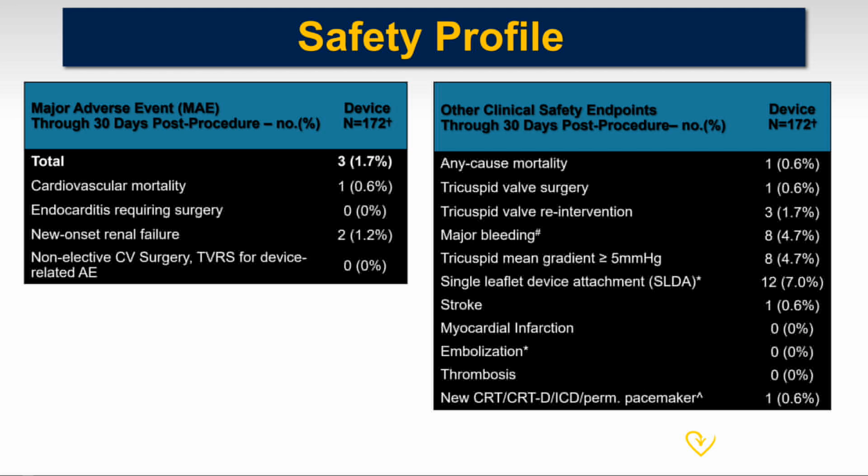This has already been published in multiple studies, and I'll just share a couple highlights. First is the safety profile. You can see it's a very safe procedure. 0.6% procedural mortality, very low mortality. Cardiovascular mortality, endocarditis is low, new onset renal failure. You can see risk of bleeding, all these things are very low. So overall, it's a very safe procedure.